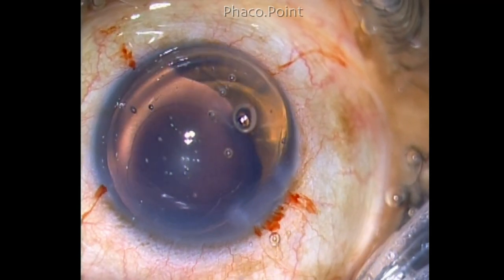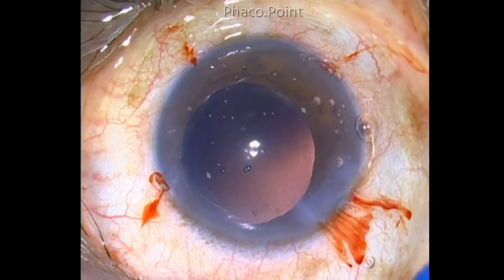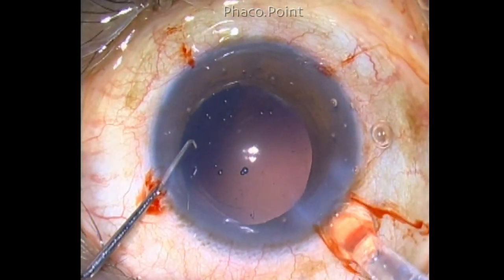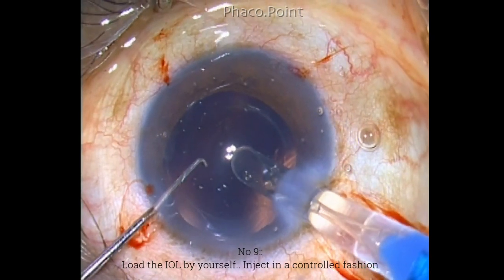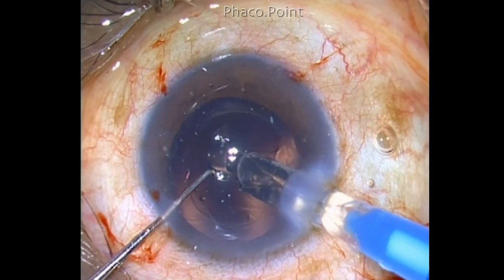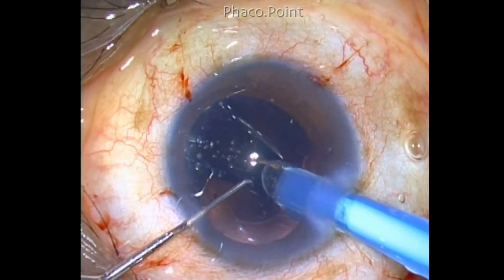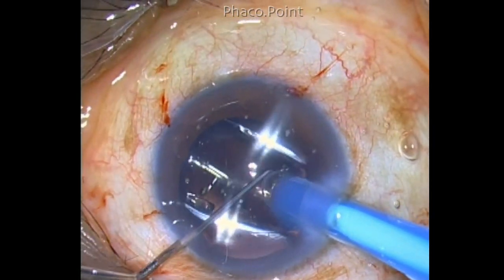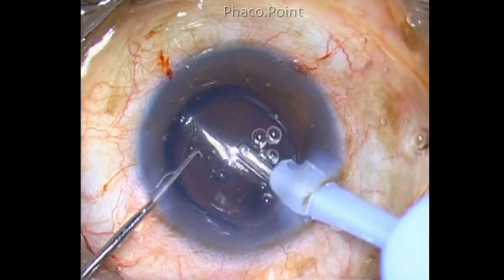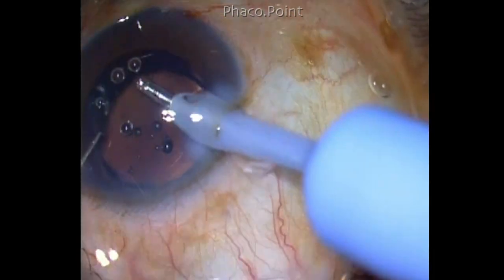The next step is the implantation of the intraocular lens. Load the IOL by yourself — even though it takes a little more time, you are 100% sure that you do not create a mix-up. Inject the lens slowly. Remember, the IOL shoot is a phenomenon produced purely by the surgeon. The IOL is an inert object; it will not shoot by itself. The only way it shoots is if you give too much power or are too precipitated. Be very gentle and careful in injecting the IOL so that you don't have a sudden gush of the intraocular lens, which will create damage to the capsular bag.